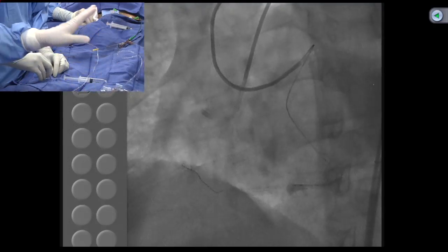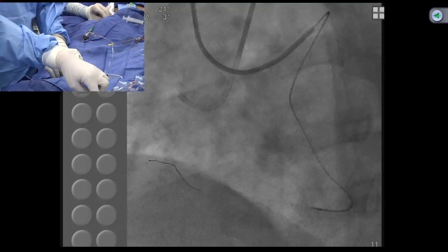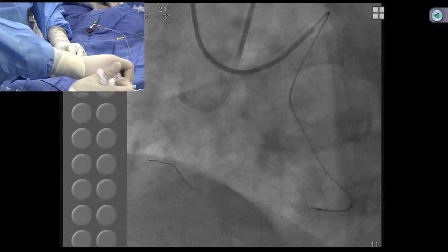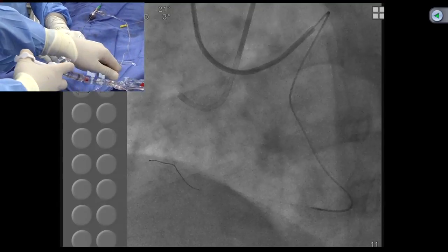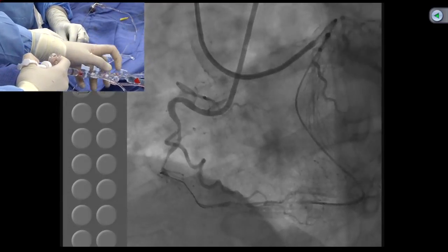I think this will be the good one. You want to take just a picture? Get a picture here. Okay, you will inject. Good. We're doing both injections? You don't need both, I guess. Yeah, just to say.